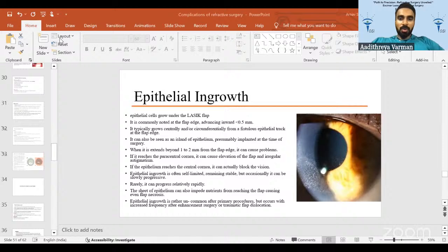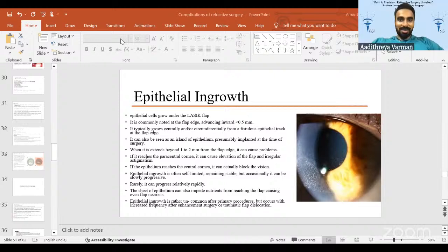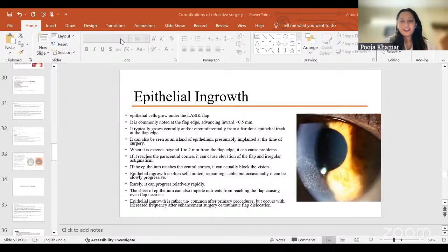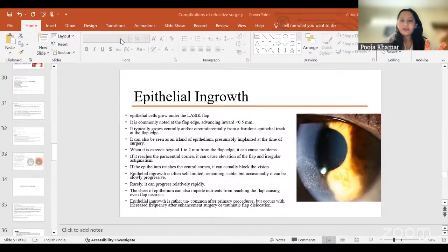I know I again am sounding a little over-precautious, but do you use cyclosporin for your patients? No, I do not. Again, it's an overkill for many, but trust me, what you said, epithelial remodeling, is a pseudo regression, it's not a true regression. Correct. And even if you say that epithelial remodeling will happen, I'll probably do a PTK or something, but it's not always the right thing.